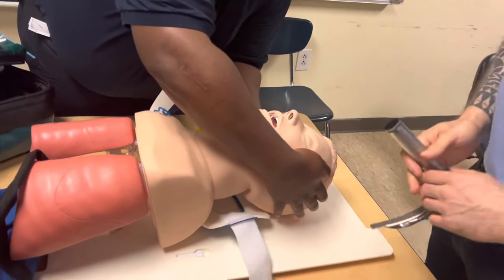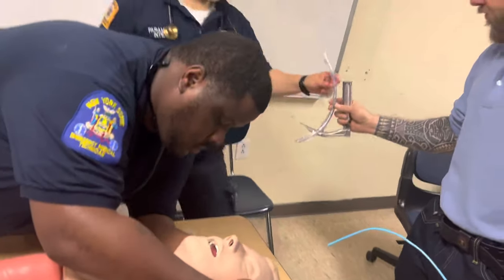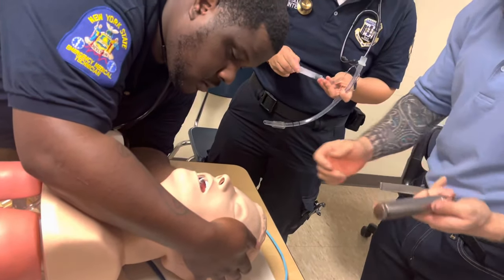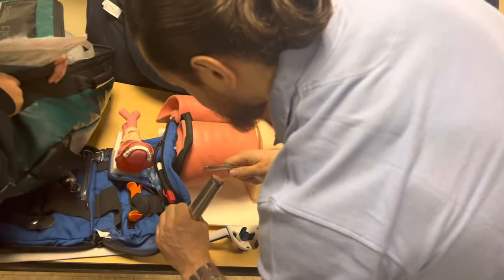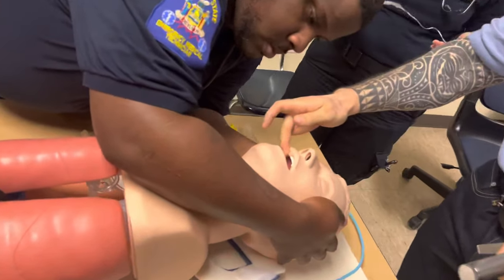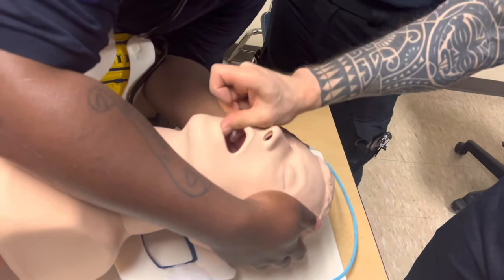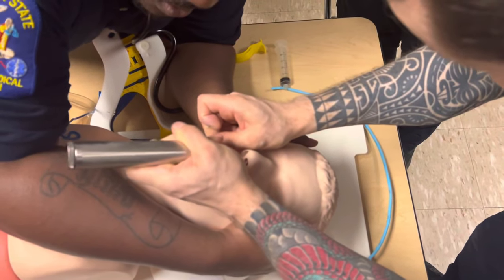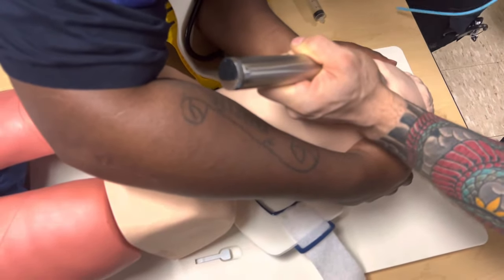I need this mandible to be mobile. Lita, you're going to be another partner - you've got the ET tube and you're going to put the syringe on. So we're going to use a number three blade. The cross-finger technique - middle finger on the maxilla and thumb on the mandible - this technique opens the mouth. I'm going to come from the side and just inch in, and what I'm looking for is just a sliver of the epiglottis. When I see it, I'm going to insert into the vallecula space and I'm not going to get an optimal view.